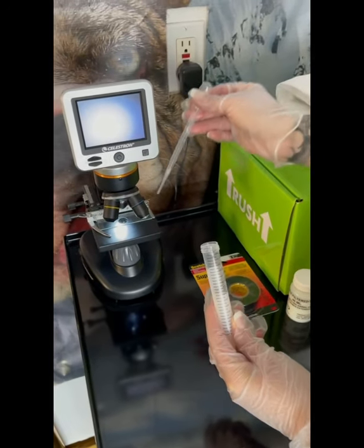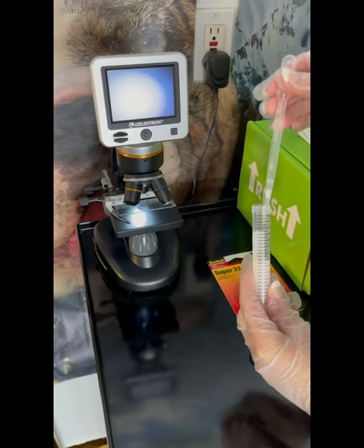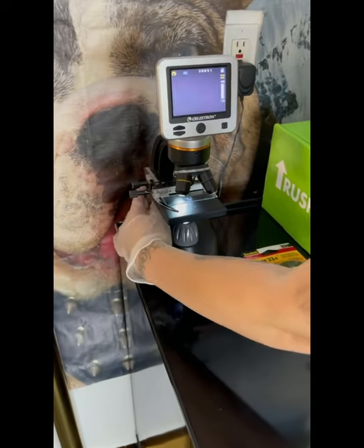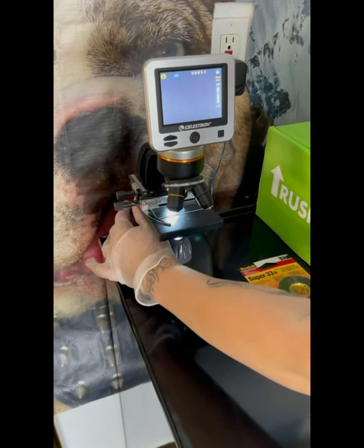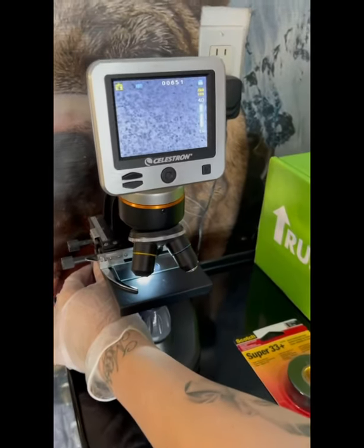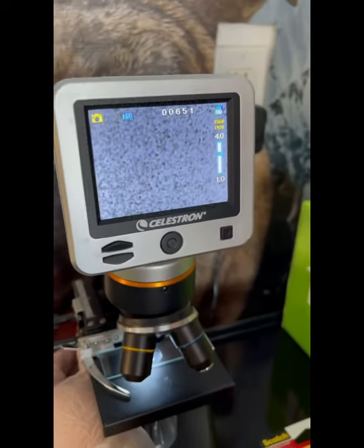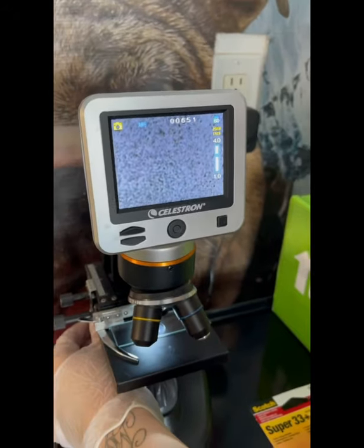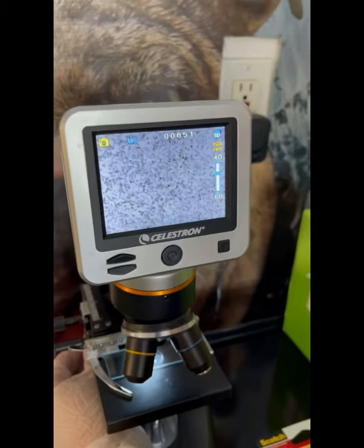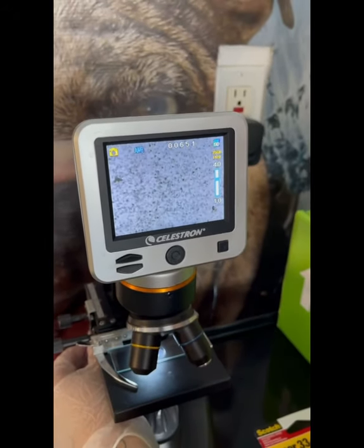Now we're going to get the semen checked. As you can see, it looks like New Year's Eve — swimmers are going crazy. Purple Punch semen always looks insane. This is what you want to see. Now we can move forward to getting it all packaged up.